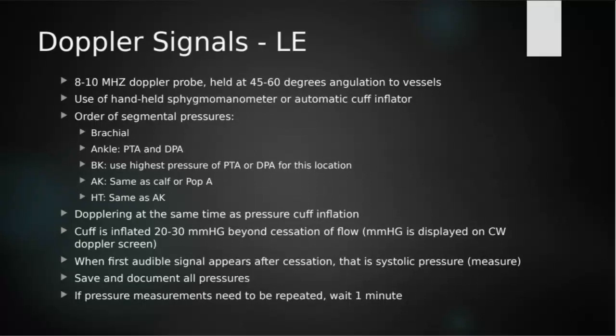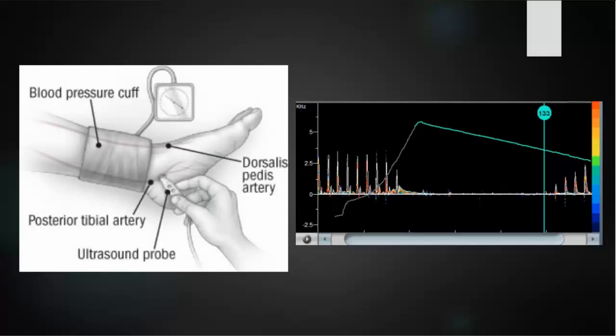We also wait at least a minute before we perform the next one. We need our cardiovascular system to kind of drop back down to its baseline. So here is what we should be doing, and here is what is typically going to occur on your machine.